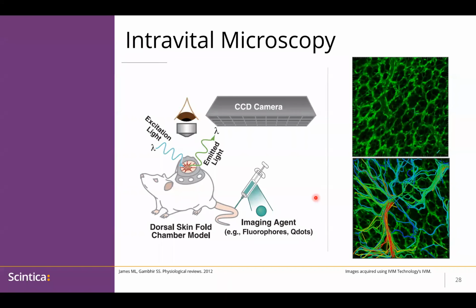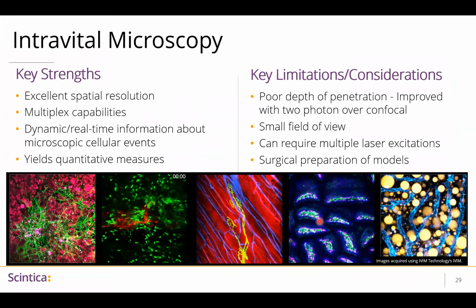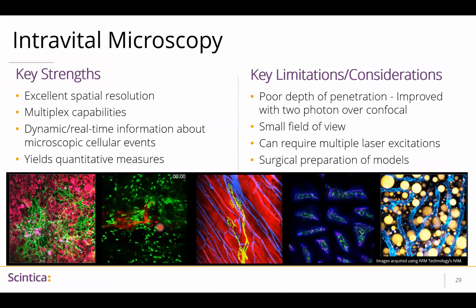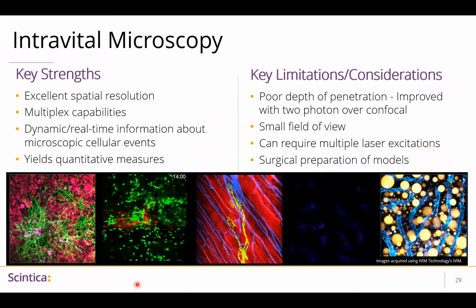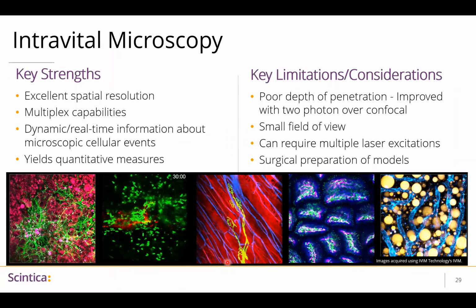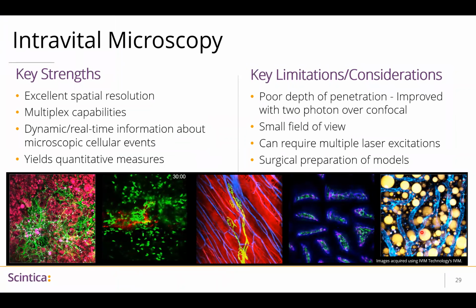Here we're looking at the movement of cells through a specific structure, and we're able to track where those cells go through. So here are some amazing, these images always amaze me when I get to see them, of different structures. And we can see here an inflammation response where I believe these are neutrophils homing to a site of inflammation, neuromuscular junction, colon, fat in the liver, with tremendous resolution.